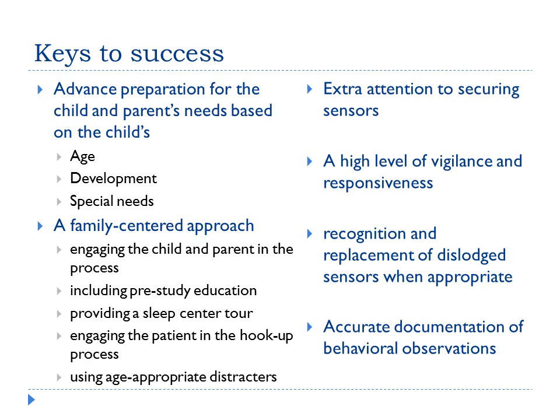And what this is referring to is if the patient just fell asleep and an electrode goes bad and they took a long time to fall asleep, you may choose to just leave that electrode as is until the patient wakes up again. You may not want to disrupt them and waken them when you've struggled to get them asleep. And lastly, accurate documentation of your behavioral observations as well as any interactions or interruptions in the study. This concludes this PowerPoint.